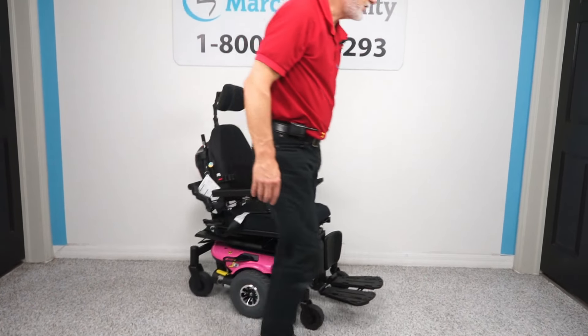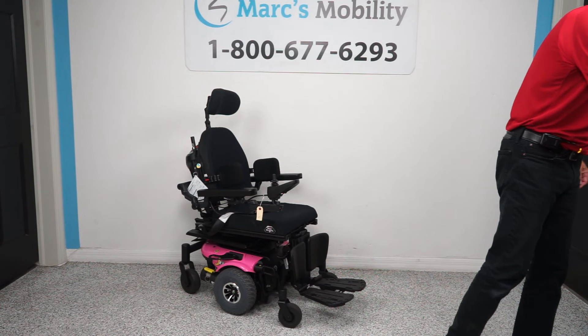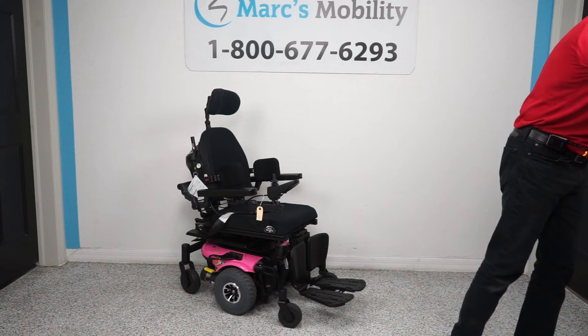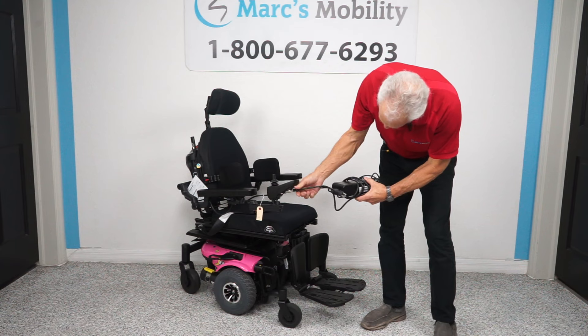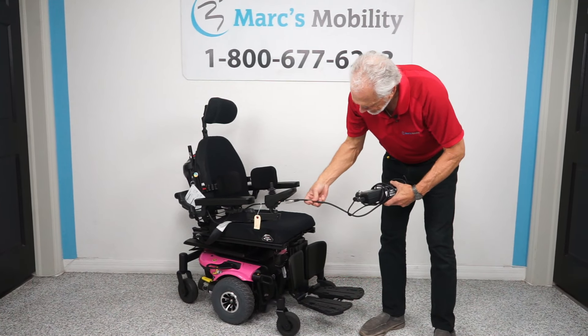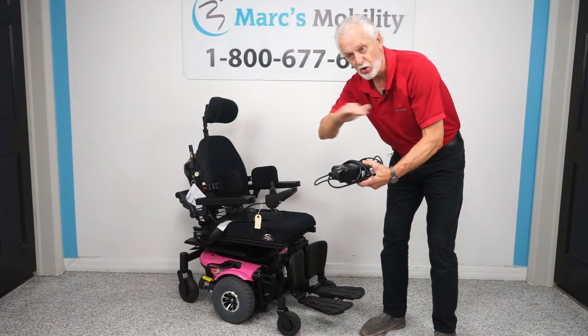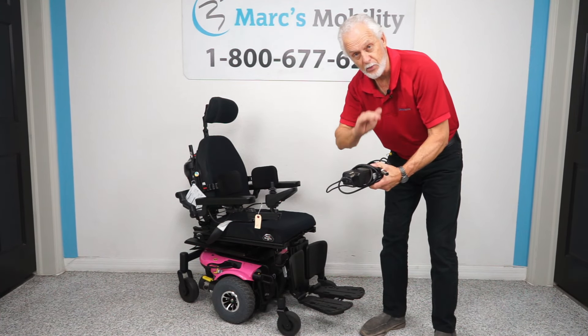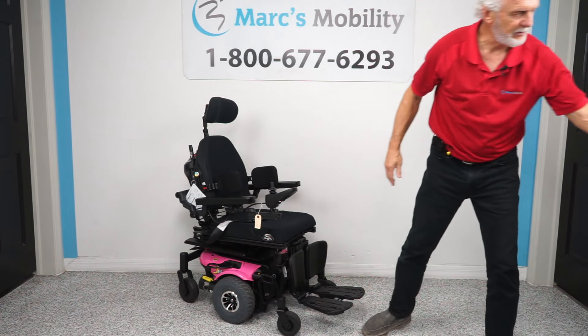When you charge the batteries in this chair, you take the charger that comes with your chair — it plugs right below your joystick. As soon as the light goes to full or turns green, the charger will cut off. The charger will still be on but won't be charging. As soon as the batteries are full, the charger will cut off. These are smart chargers.